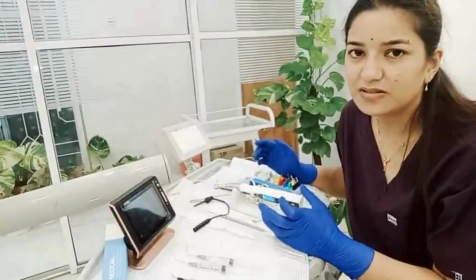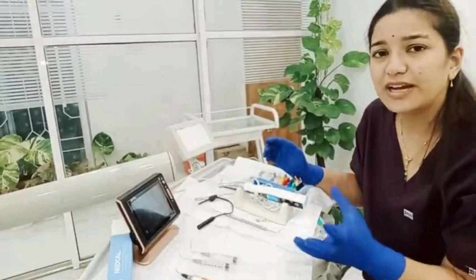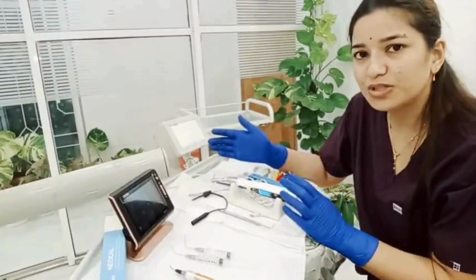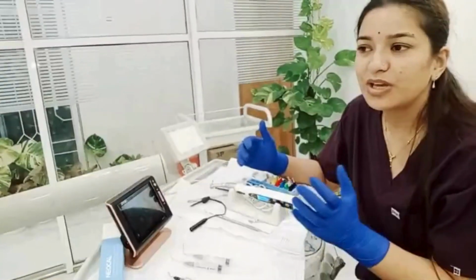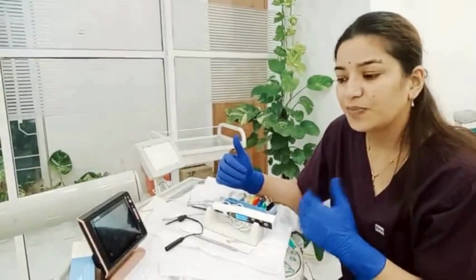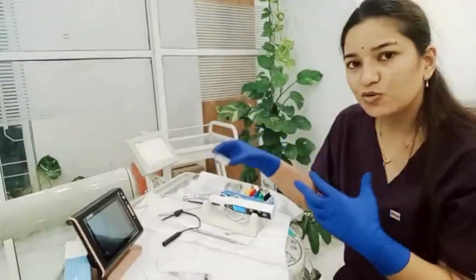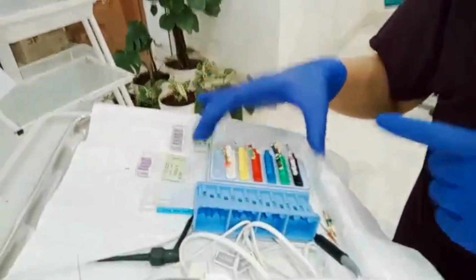This was my experience here. I had to tell you before that, whenever I used endomotor, I didn't know how to use it, what techniques we are using, how to use hypo exactly. So here in Aero Dental Clinic, I used everything. We have been provided with each and every product, each and every material here, whatever we want. These are new file systems, and these are rotary files which we are using.